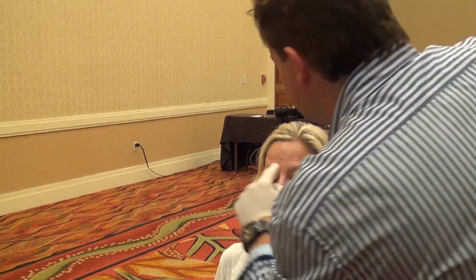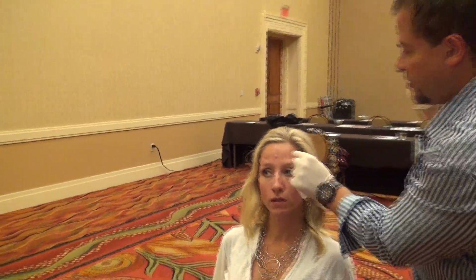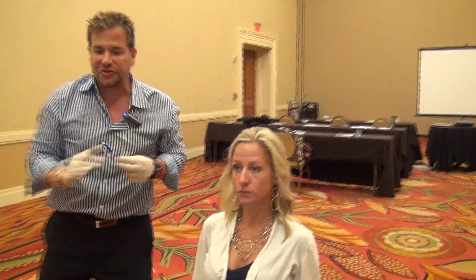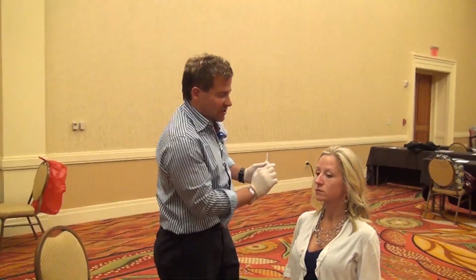And what you can see is it's perfectly straight. That's important. So you don't want to put 4 units here and 2 units over here. You don't want to make it crooked. You want it nice and straight. And the instructions for the patient is not to rub on it or anything like that, but it's nice and straight. That's important.